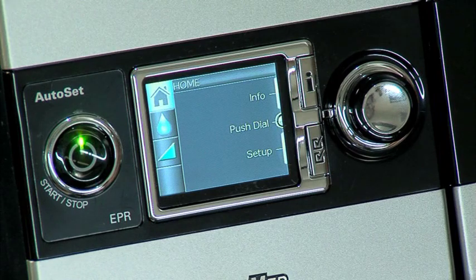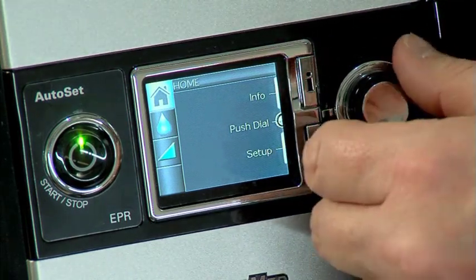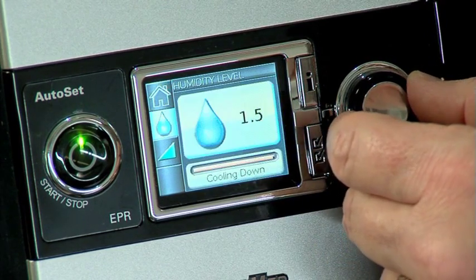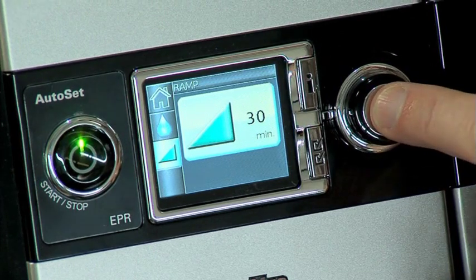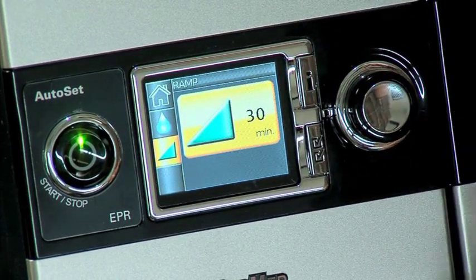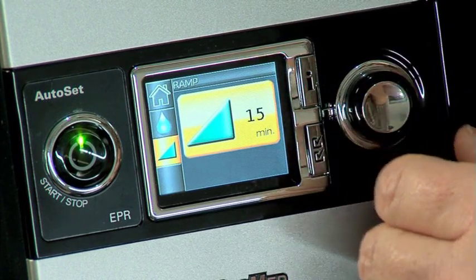Your system includes what is called ramp time. This feature is designed to make the beginning of treatment more comfortable. Ramp time is the period of time during which the pressure increases from a low start pressure to the prescribed treatment pressure. To adjust your ramp time, begin at your home screen and turn your push dial until the ramp is displayed in blue. Then press the push dial to signal that's the setting you wish to change. Turn the push dial until the desired ramp time is displayed, then press the push dial to confirm your choice.